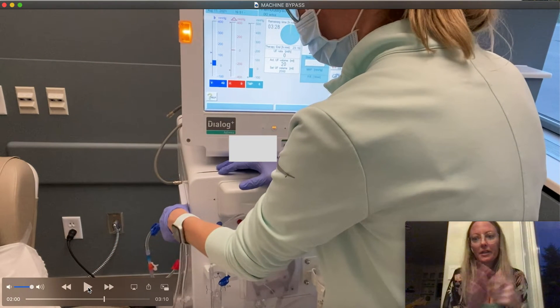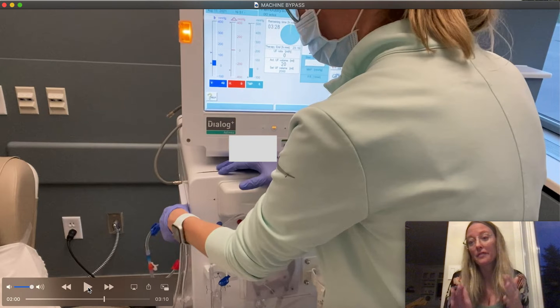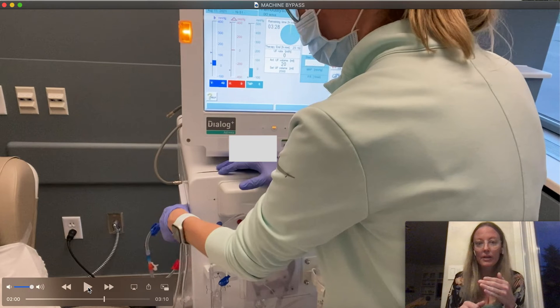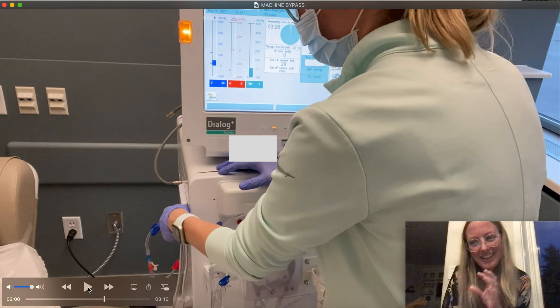Before they come back from the bathroom, I am going to get a sitting blood pressure. Best practice would be to escort them to the bathroom in a wheelchair, even if they can walk. The last thing you want is somebody going from laying to sitting to standing in a hurry, going to the bathroom, and then falling flat on the floor and passing out. Best practice is to very much encourage them to use the wheelchair. This is something I learned from nurse Jamie — thank you, Jamie, for the tip.